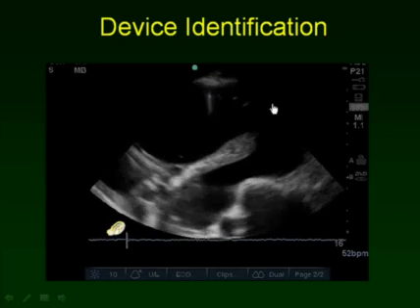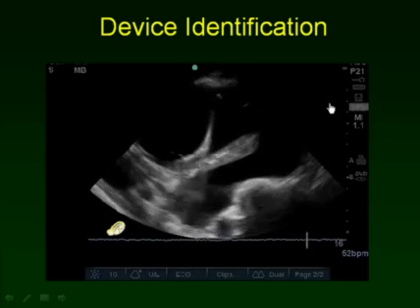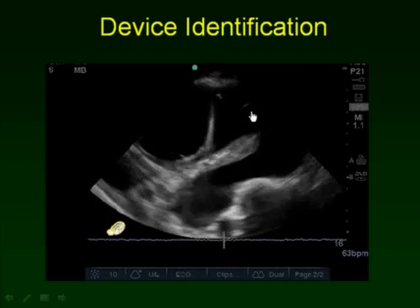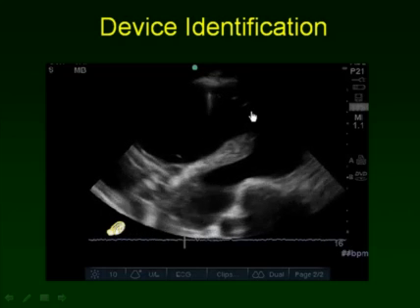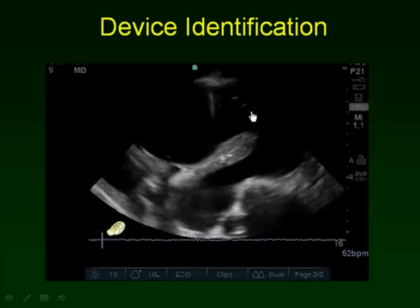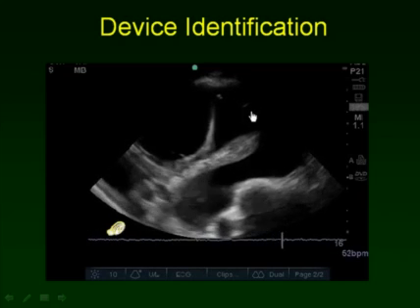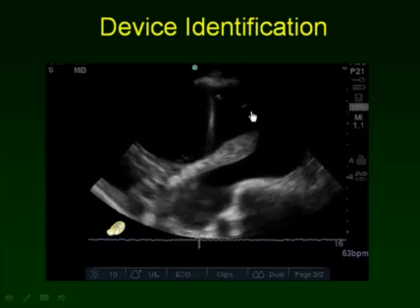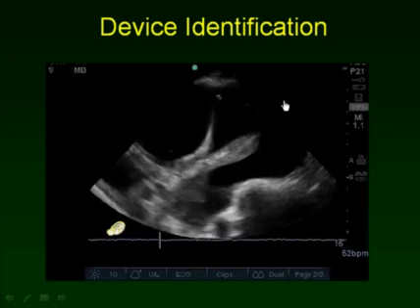We'd have to scan down 1 or 2 interspaces, but I wonder whether it has a reverse curvature. Very large effusions are found to invert the diaphragm, and there are some who say that with diaphragmatic inversion, the patient at that moment will become severely dyspneic from the effusion. We have some dynamic findings, obviously, movement of the lung.